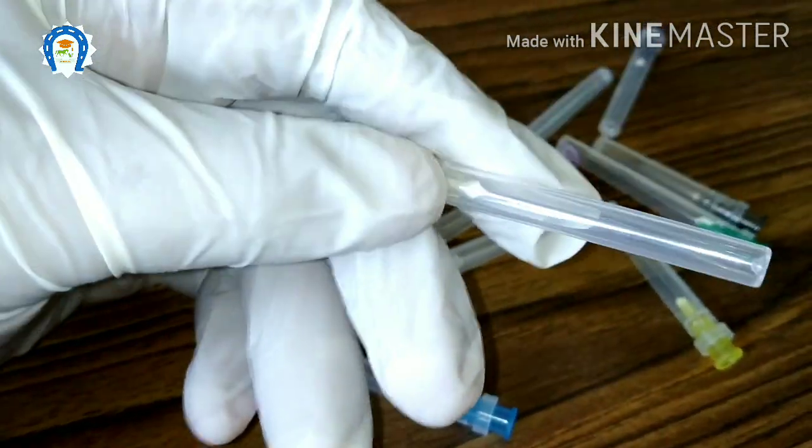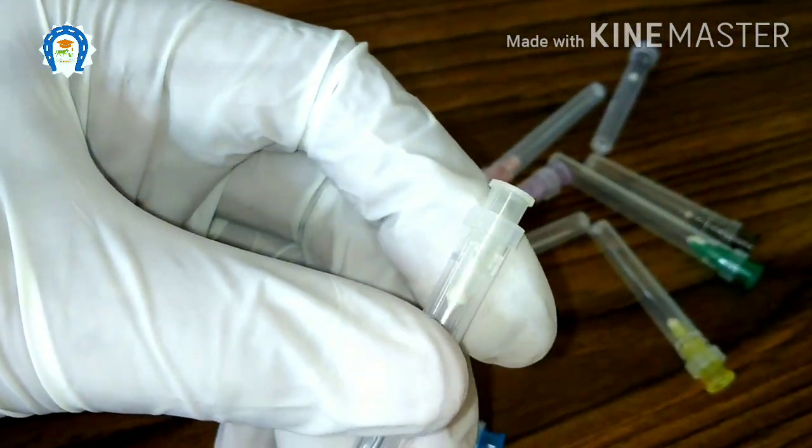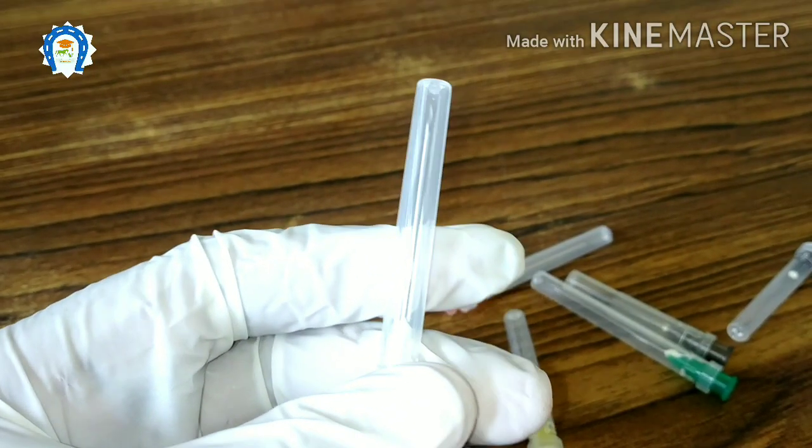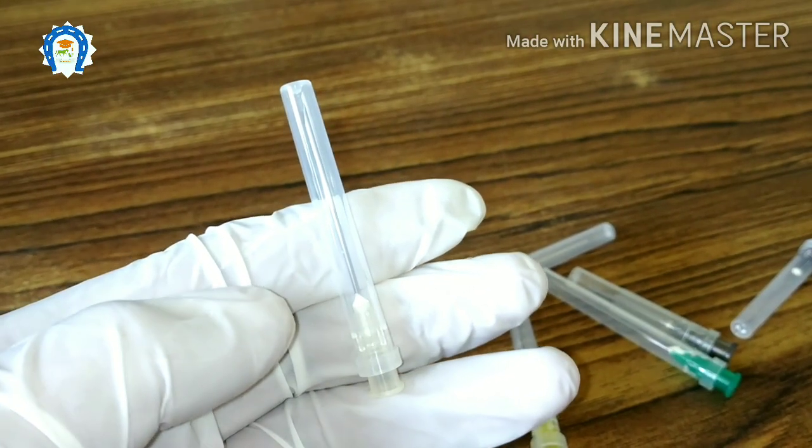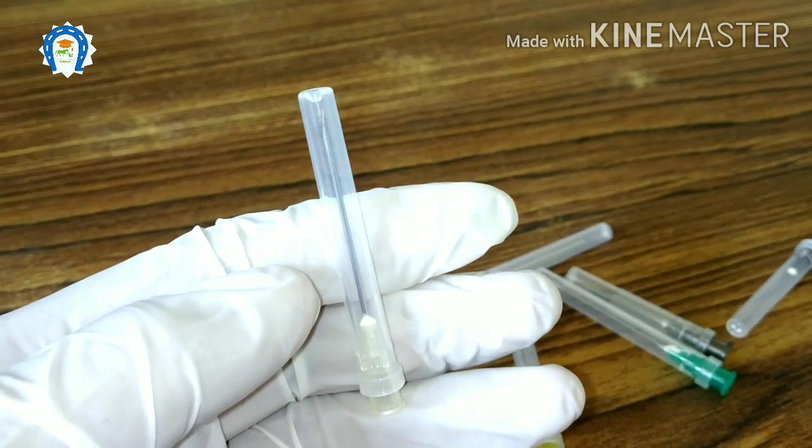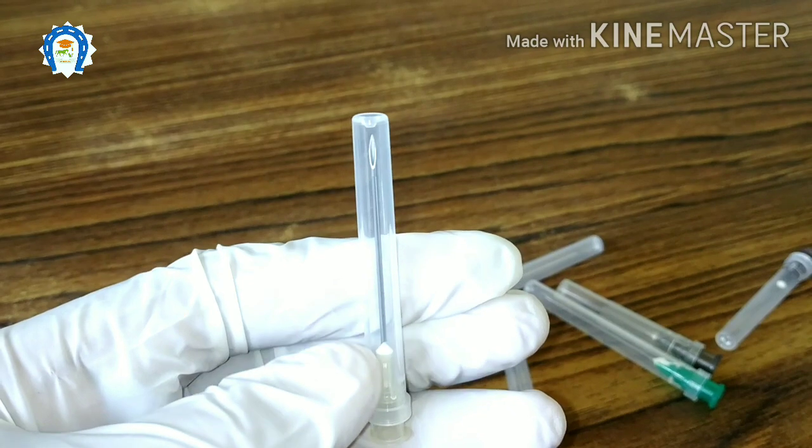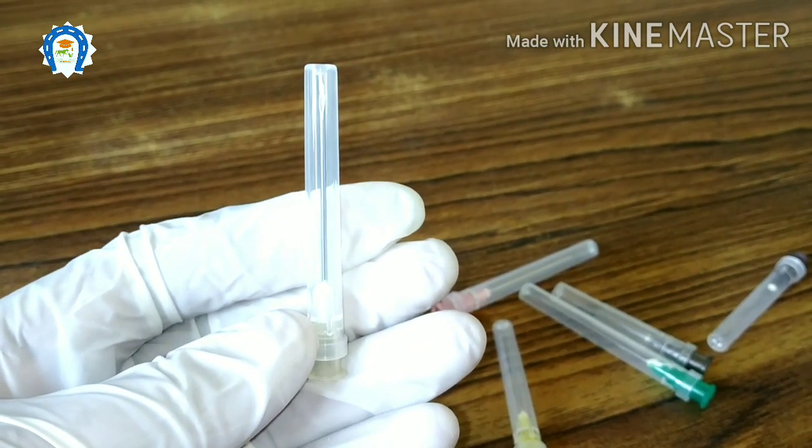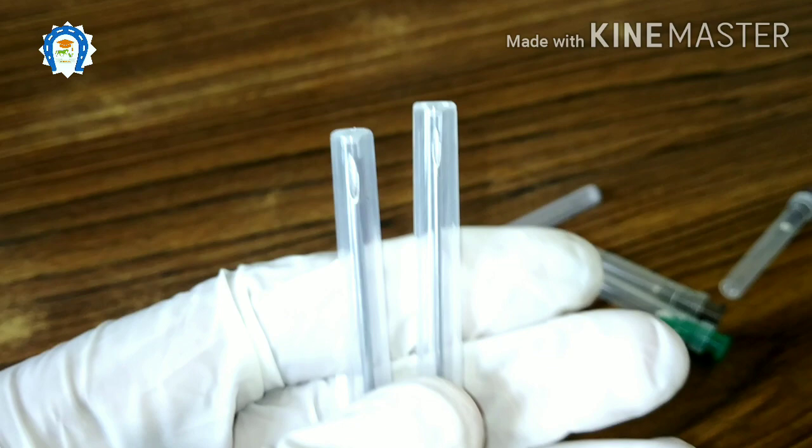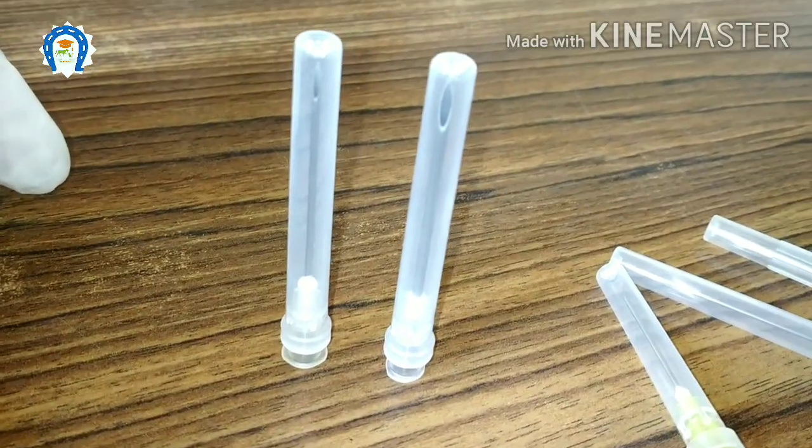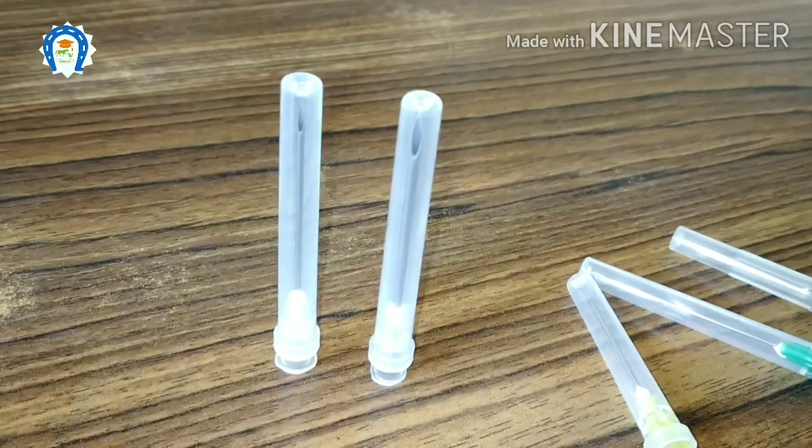This one is the 19 gauge needle, slightly dull white. We can use this for intramuscular and intravenous injections in large animals. This is not too big or too small, very ideal to administer injections in large animals. Most of the water-based injections can be administered with this needle. We have to be very careful because we may get confused with the 16 gauge needle, which is also white in color, but this is a little dull.